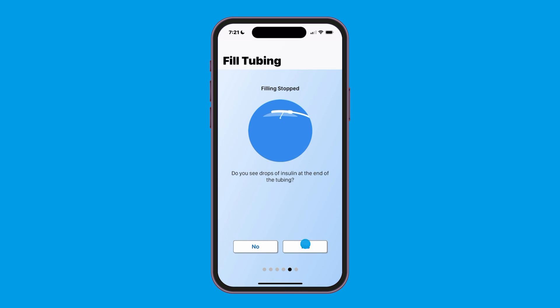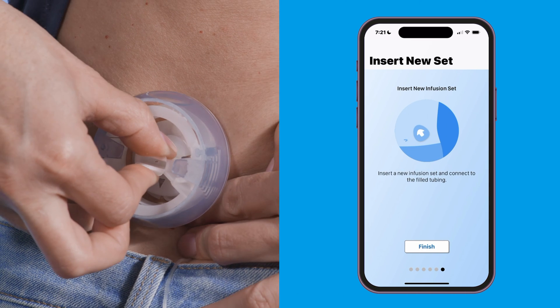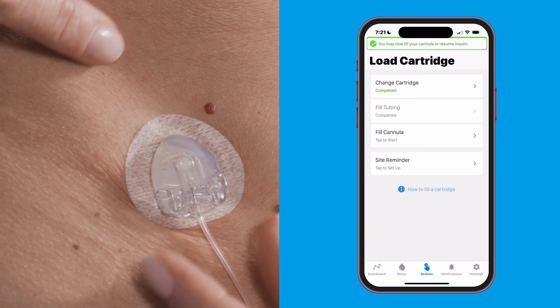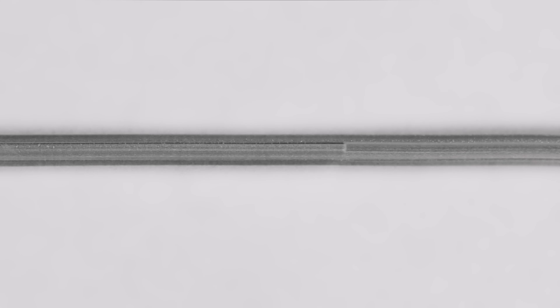Tap yes if you see drops of insulin at the end of your tubing. Complete the process by inserting the infusion set. Make sure you're inspecting the tubing for air bubbles. Air in the tubing occupies space where insulin should be, and this could affect insulin delivery.